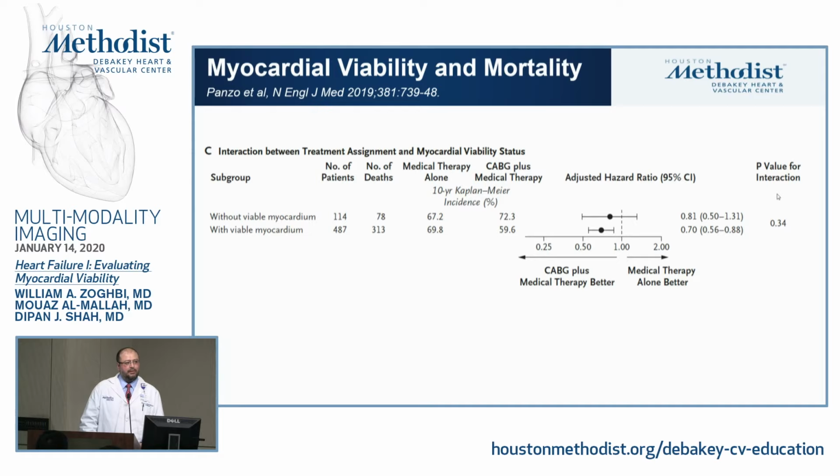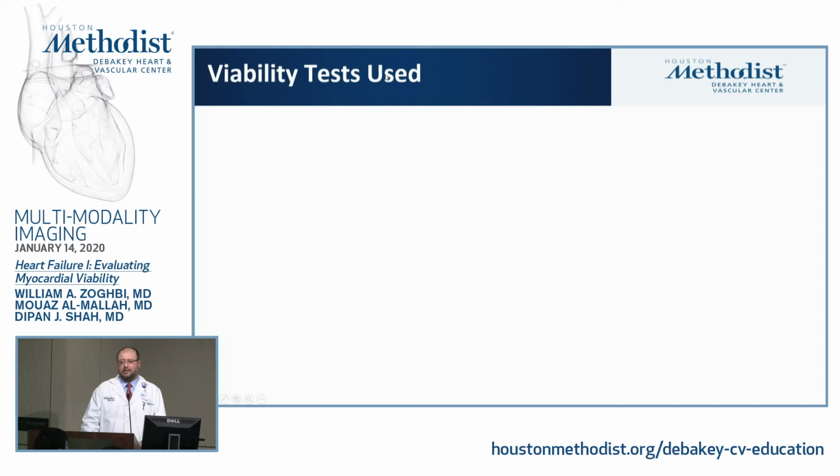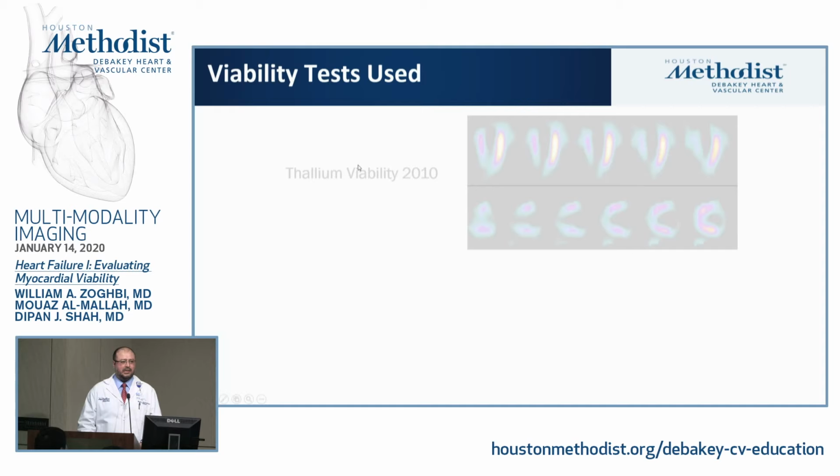Now, there has been a lot of discussion about why this happened in the STITCH trial. This is not what I want to discuss. I just want to point out one thing, which is that the STITCH trial did not use some of the advanced modalities, which could be one of the reasons for these results. And we know now from data that, at least looking at SPECT imaging for viability assessment, thallium imaging may miss some viability in this patient.